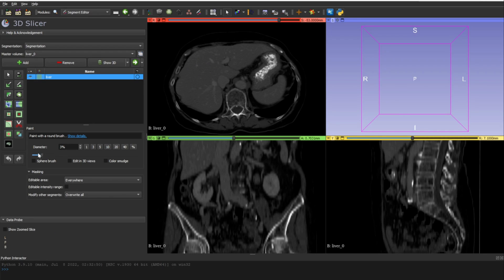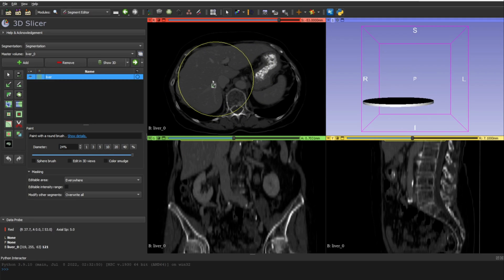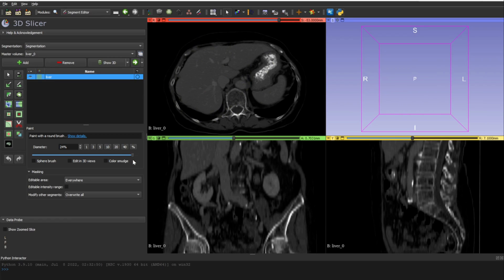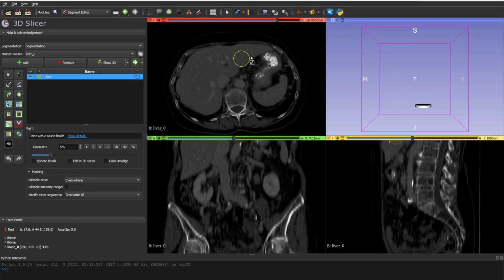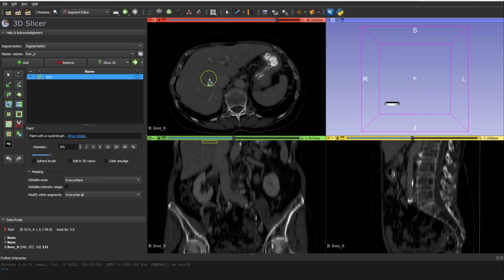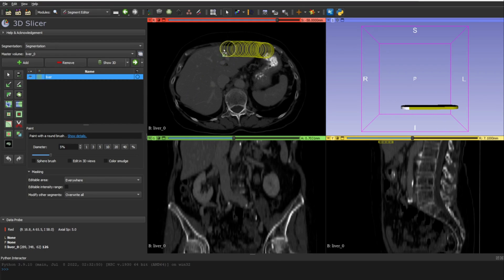With the brush icon selected, you can adjust the brush diameter using the scroll here. For example, scrolling gives you a bigger brush, but we don't need that right now. Let's keep it at a moderate size to be a bit more precise with the borders, though you can make it bigger at any time.